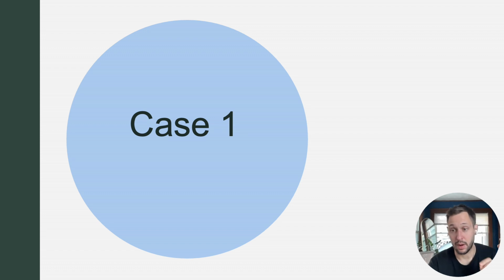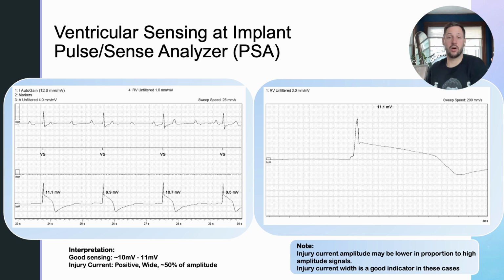So now we're going to look at some cases that are a little bit more complicated, or at least worth studying. All right, so this was actually from a previous presentation that I've done, and I will cite it at the bottom of this video. And I highly recommend you watch it because it's a deeper dive, and I'm not going to cover all of the concepts from that here. I'm just going to cover some high-level things.